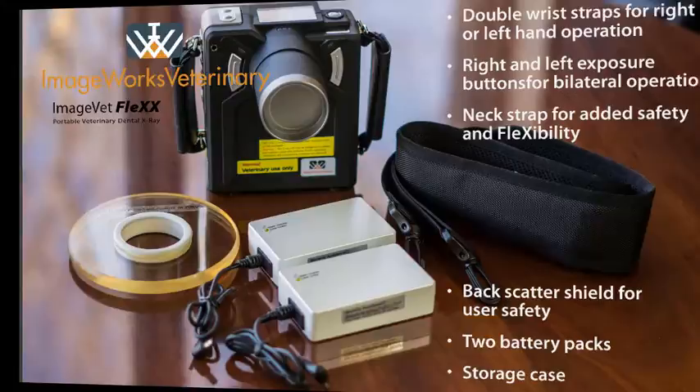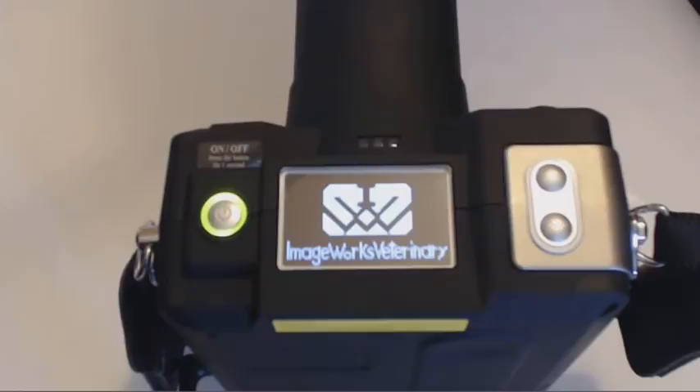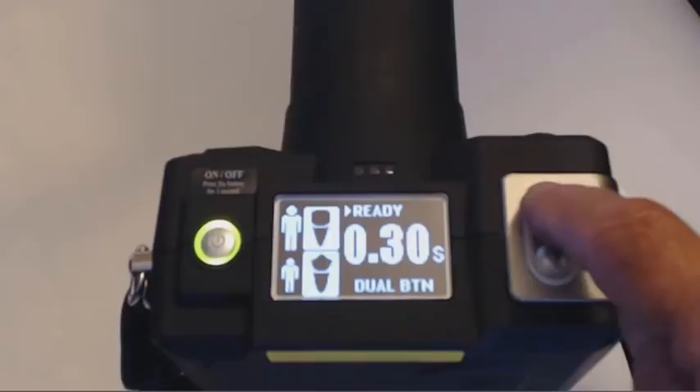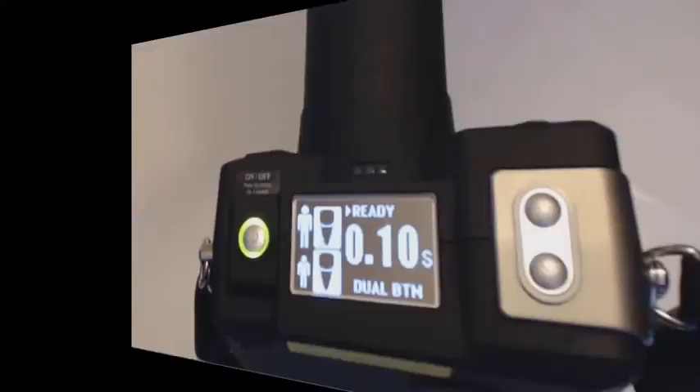It's easy to operate, which I'll demonstrate now. To turn on the unit, press and hold the on-off button located on the left top side of the unit for about one second. Notice the ImageWorks Veterinary logo is displayed followed by the main menu. To adjust the time settings, press the up key to increase and the down key to decrease. Notice that the time changes in 0.05 second intervals.